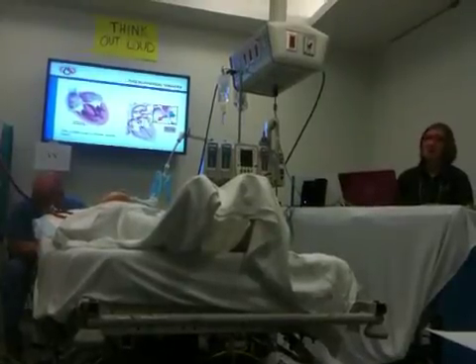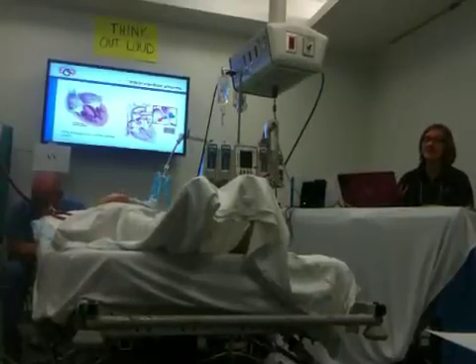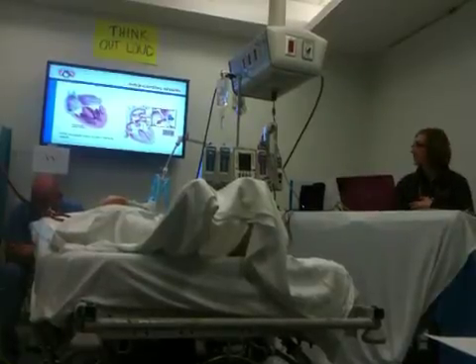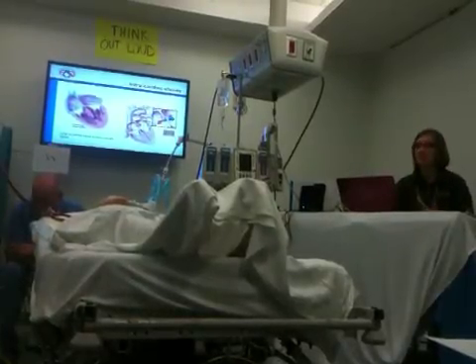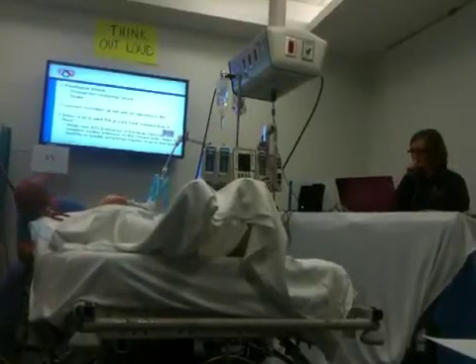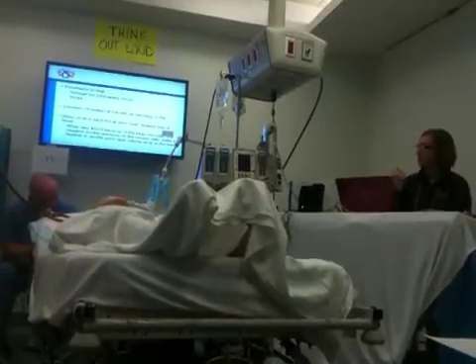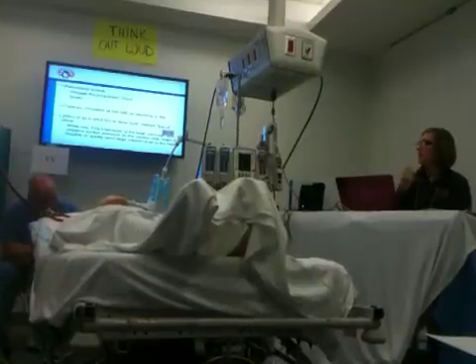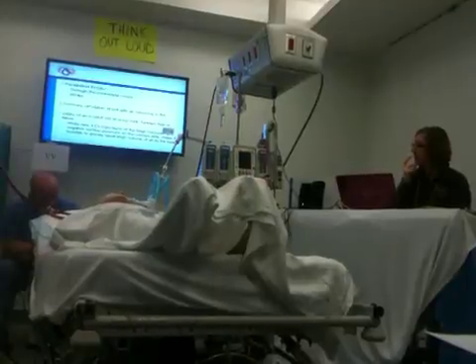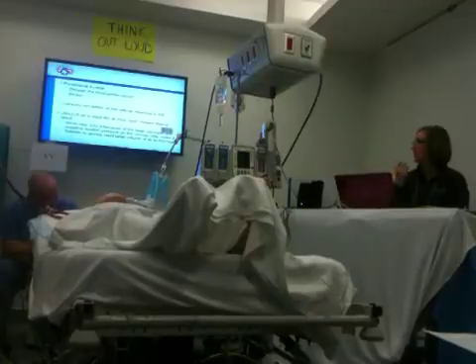But if you didn't know and your patient has an ASD, you're going to have some trouble with injecting 60 cc's of air into that right heart, because then it will be going to the left heart and all over the place. So just being cognizant of those things. Microbubbles probably not going to be a big problem in that respect. And that's what they wanted me to focus on too, is that through those intracardiac shunts, you're worried about stroke. You're worried about coronary circulation due to that air getting in that right atrium. And then 200 cc's of air in the adult right atrium at once will lock the forward flow of blood.